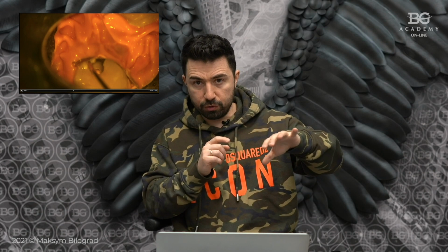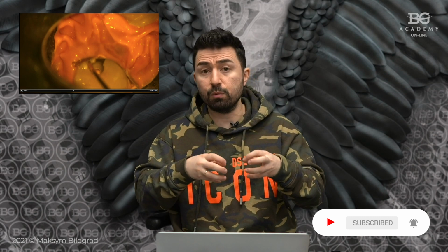We put a drop or a few drops, and we didn't light cure it. Then immediately we took preheated composite, and gently we were able to pack it with a micro brush. This technique will allow you to fill all the gaps with flowable and to create the main volume of the defect with packable composite.